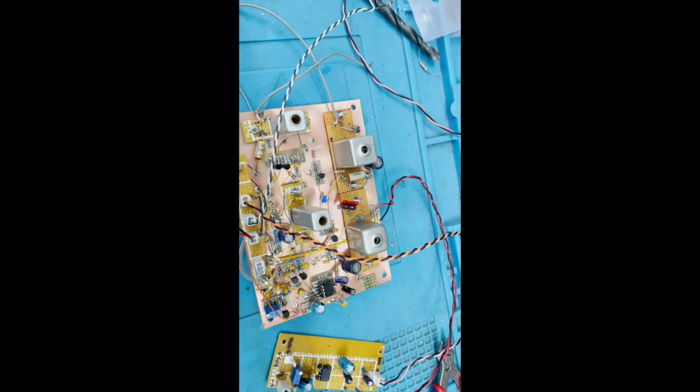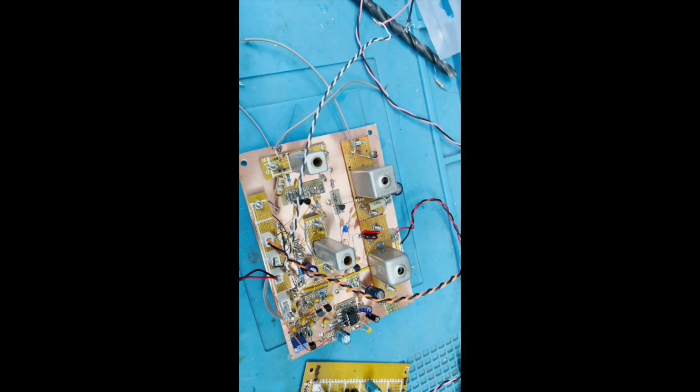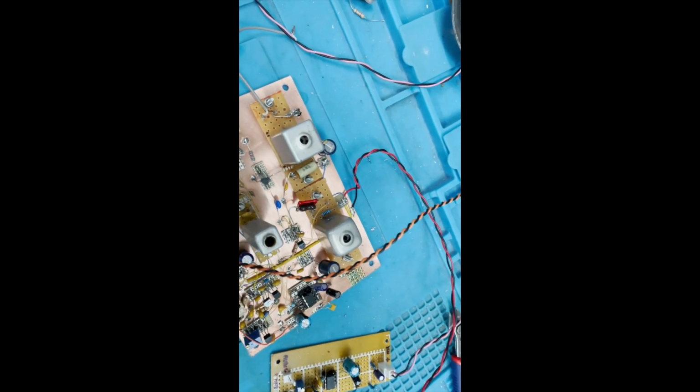So this is the Mark II version of the board, which I've built kind of point to point, if you can call it that, with bits of strip board glued on to mount the various components. And what I found is that using a copper clad board certainly makes a big difference. So if you're thinking of building something like this, bear that in mind, and use something like a copper clad board, or if you want to go the extra mile, you can always do a proper PCB. I haven't got much patience with doing my own PCB, so I thought I would just do it like this. Anyhow, I'm just going to grab a pencil and quickly show you what's what.